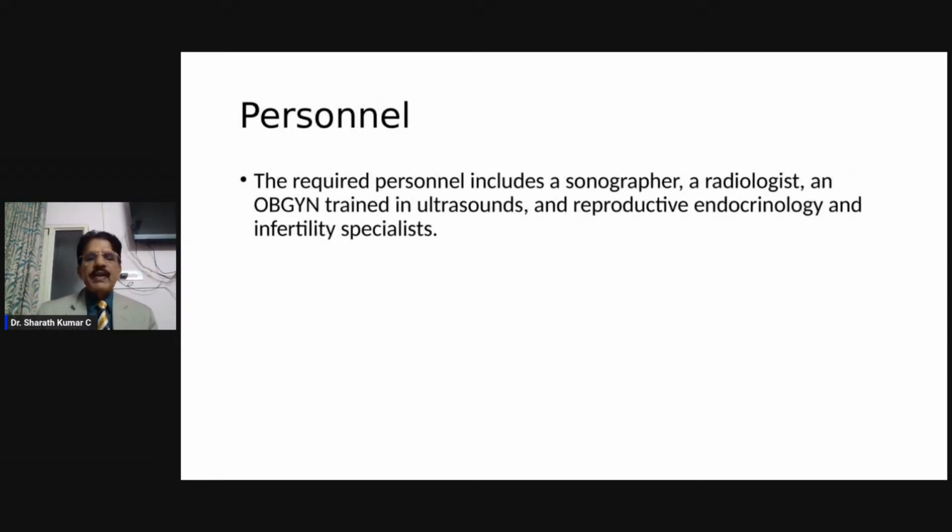Personnel, of course, should be a radiologist or a gynecologist well trained in ultrasound, and also reproductive endocrinology and infertility specialists. These are all the people who are qualified to do the ultrasound scanning. And of course, as per the PNDT Act, taking the license to do the scanning is very, very important. Though you may not be doing OB scanning, still to do the transvaginal scanning or any other scanning, as per the PNDT Act, taking a license is very, very important. Even if you are qualified, even if you are MD Gynec or MD Radiology, you have to take a license.